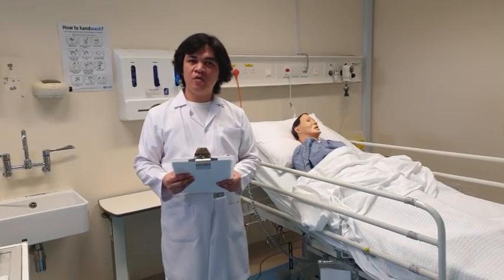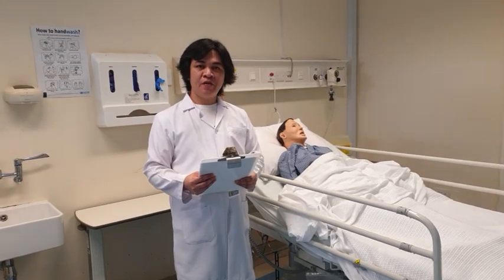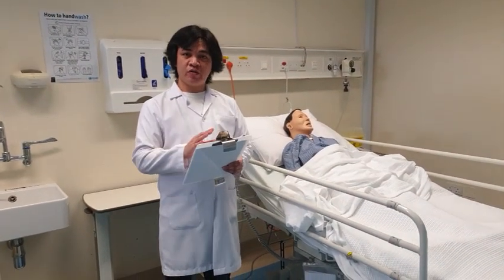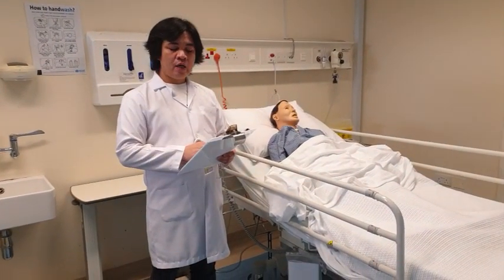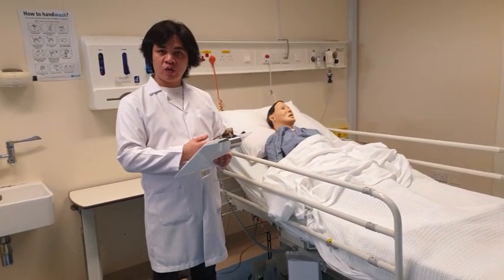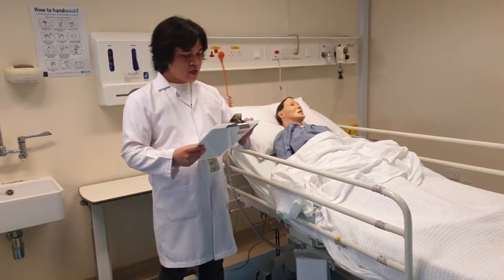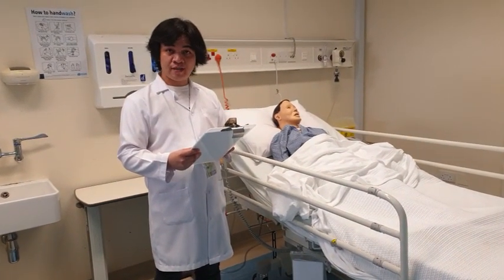Hello everyone. So this morning we're going to perform surgical wound dressing. The first thing that we're going to do is to check for the doctor's order. We need to check if there is a prescription or order from the doctor to clean the wound of our patient. So I'll check the doctor's order, and there is an order to change the dressing.